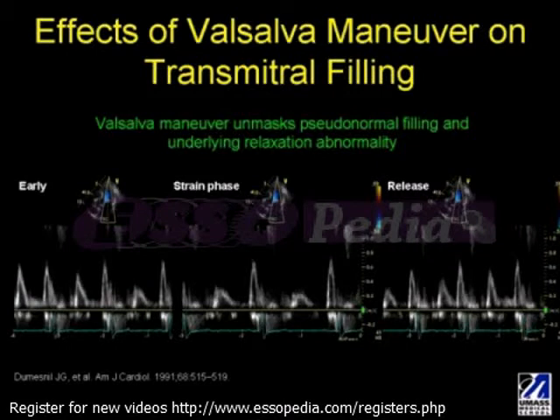Effects of the Valsalva maneuver on transmitral filling. The Valsalva maneuver can be applied to determine if the filling pressures are elevated by reducing preload and unmasking the underlying relaxation abnormalities. This technique is performed by forceful expiration against the closed nose and mouth.